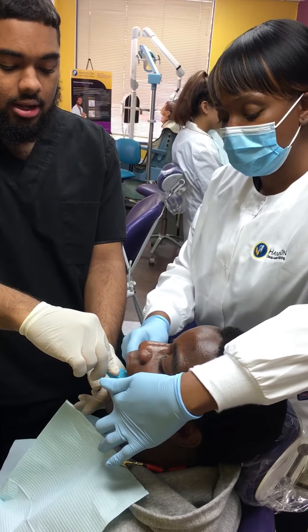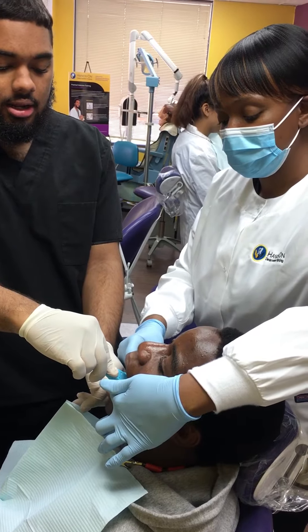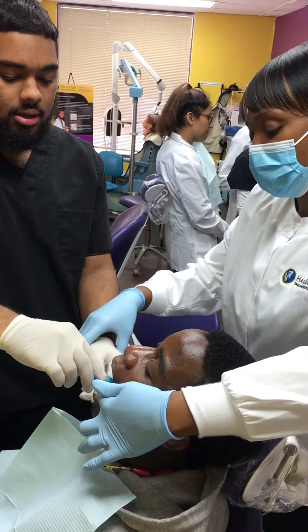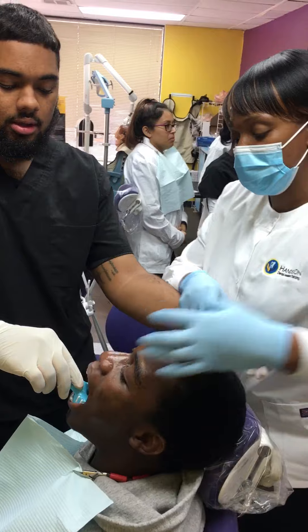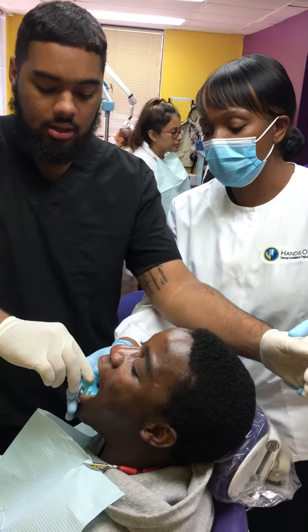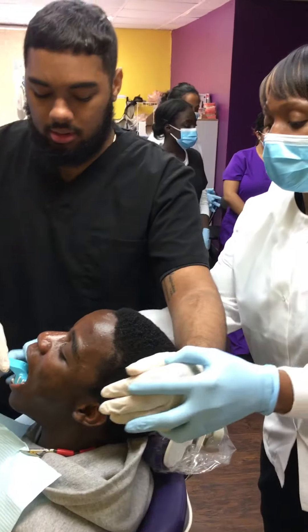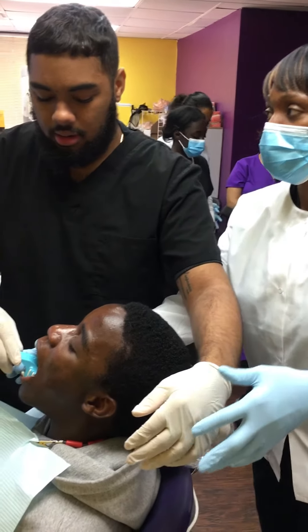So there are measurements that you can use for water. You can hold it here or you can put your hand on the patient — it's okay, just for stability. Put one hand on that side and one hand on this side. You have more control.